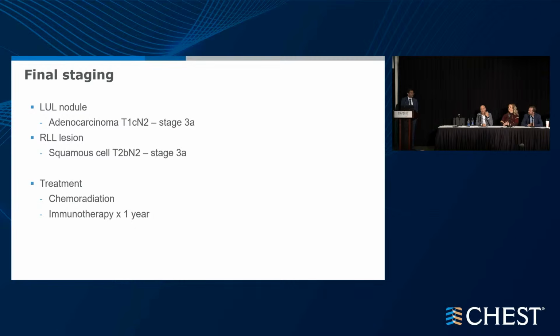All right. So all you needed was 2 needles and an EBUS. And a really good cytopathologist who can make a call in the room. Yeah, and that's a challenge. I don't necessarily get that, but yeah. You started at the left hilum, or what was your first biopsy site? 11L.